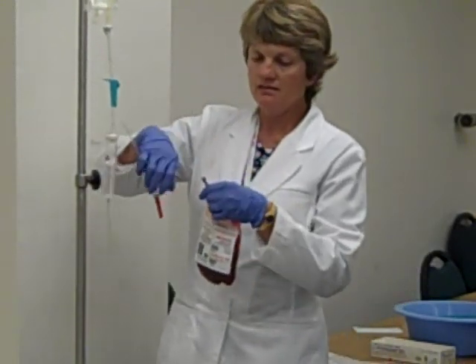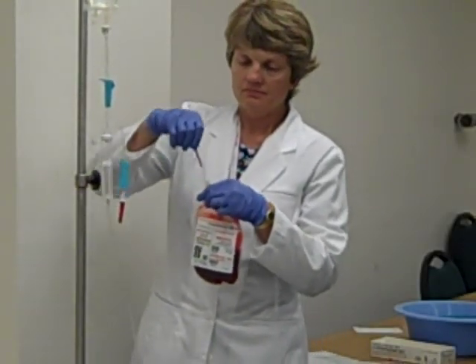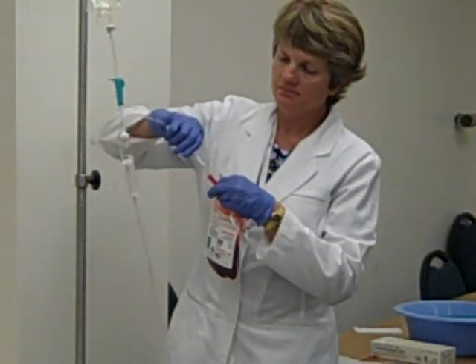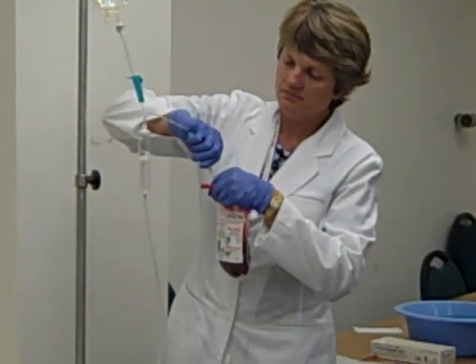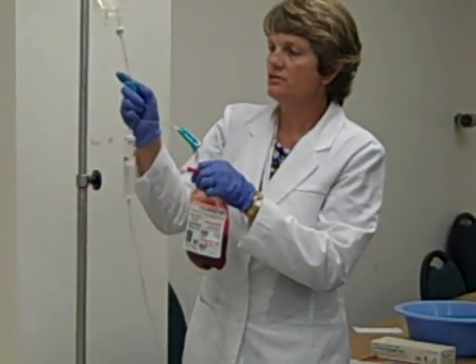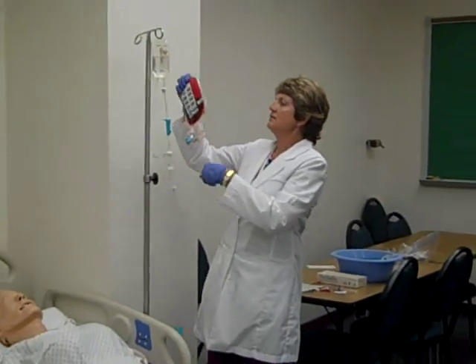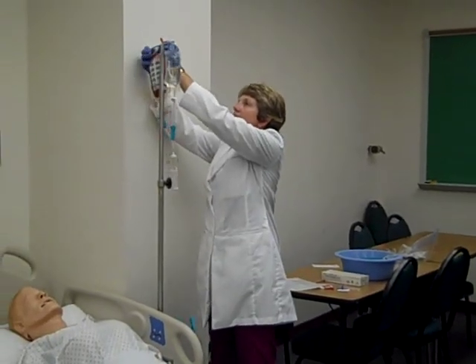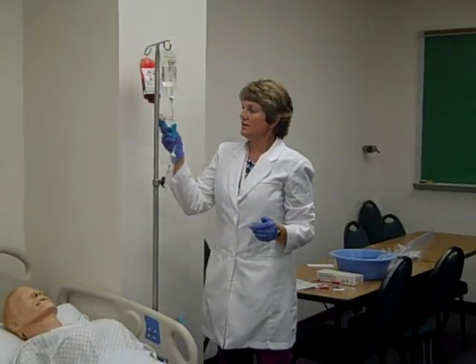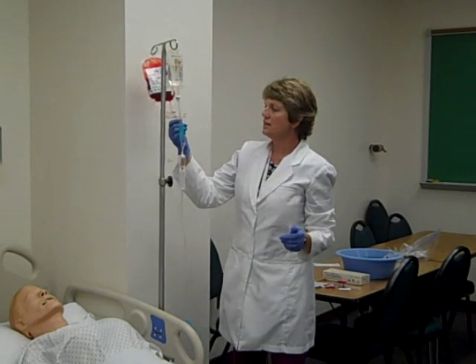Now I'm going to go ahead, take my spike out of my blood bag. I'm going to go ahead and spike it with the other Y arm. I'm going to close the clamp on the normal saline. Go ahead and hang my unit of blood. Okay. And I'm going to open up the clamp on the unit of blood.